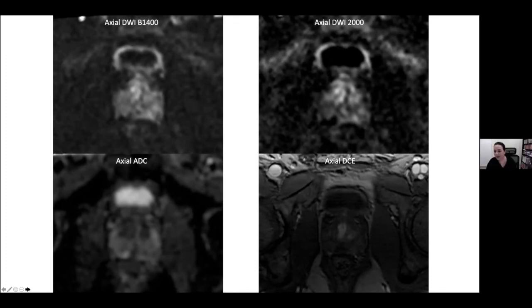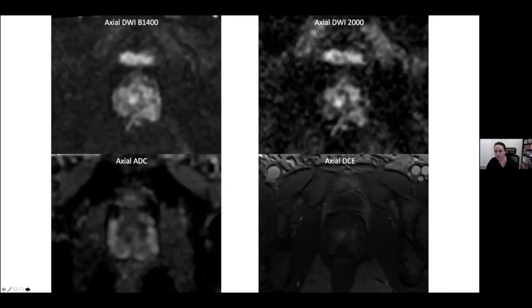I agree. And the one thing that PET MRIs taught us is if you're going to actually spend the time and money to do contrast, then actually use it to its full utility. And I initially used to use it to upscore my PIRADS lesions. But then I realized when we had MRI occult tumour, that often when it was PSMA-avid and MR occult, if you look back in hindsight, there is a confluent DCE abnormality, and we've got quite a few cases like that.